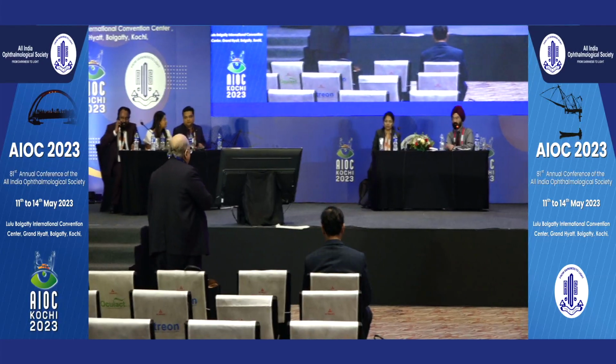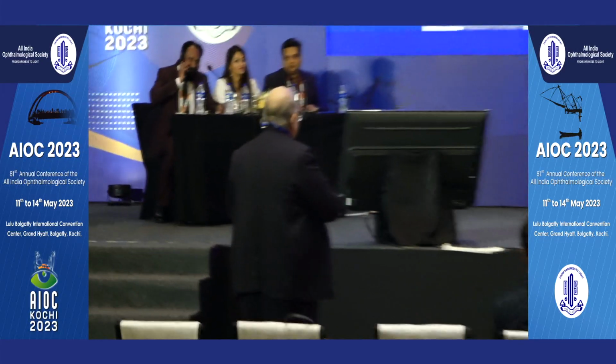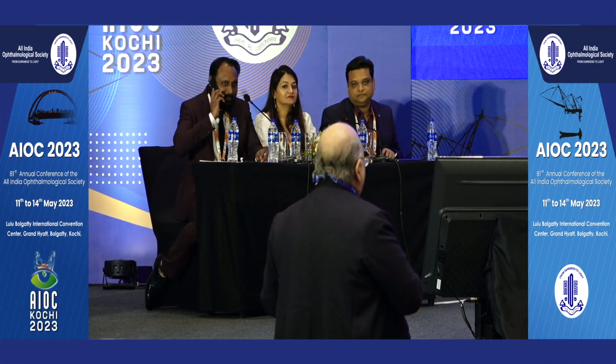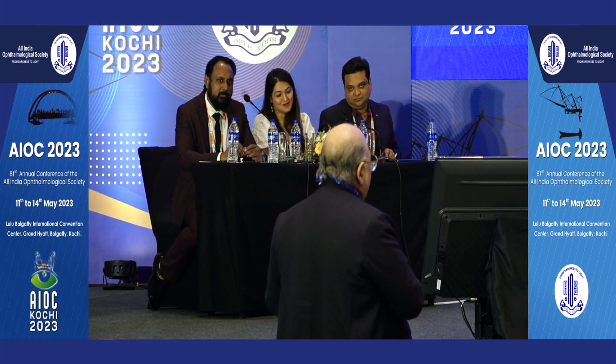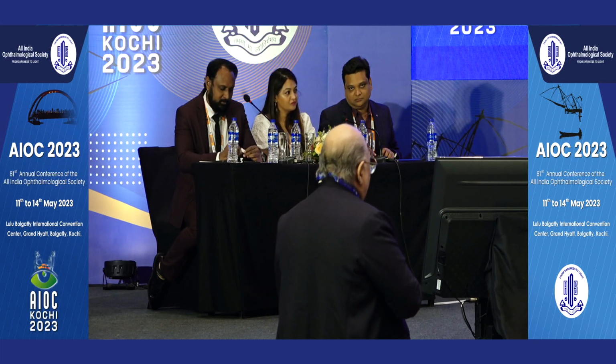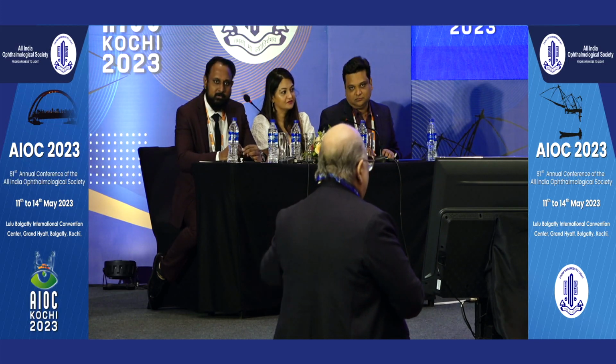Theoretically, the correct answer would be a lens which has an extended range of focus. In practice, the best lens is a trifocal. Among the trifocals, the only question you have to decide is which is the one which will give him the minimum glare and problem. Now, an ophthalmologist does require to be able to not only see his screen, but at the same time see the intermediate range. So in every way, I think trifocal is the way to go, and that's what I recommend to everybody.